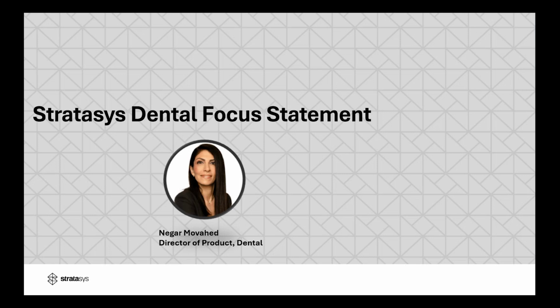Now, to share a little about what's going on behind the scenes and what's coming in the future: obviously we're laser focused on the next generation digital denture solutions. I can't give you a timeline today, but our clear goal, our holy grail, is to give you a high-impact solution, building on the polychromatic printing, that truly meets our clinical and lab expectations. I will share the four pillars that guide this development. One is obviously aesthetics.